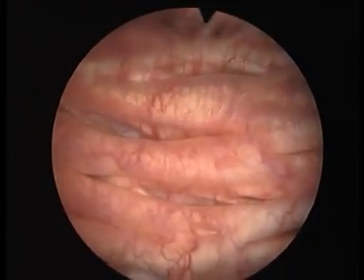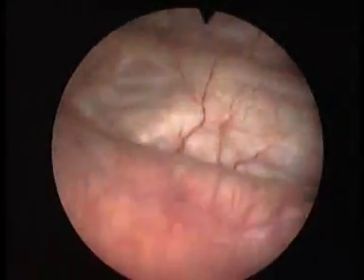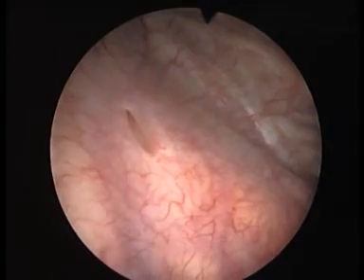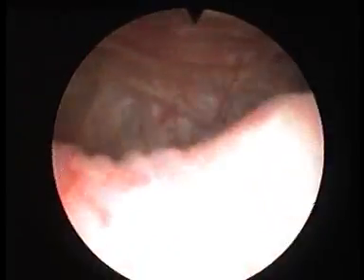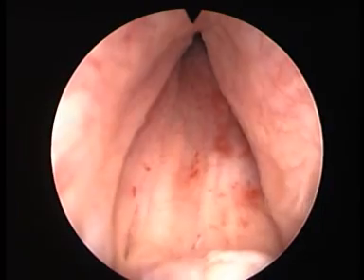Here we can see the inside of the bladder, and you can see the buildup of muscles which is caused in this case by an obstruction of the bladder neck. Looking at the right ureteric orifice where the urine comes down from the kidneys, and there's the left ureteric orifice. There's the bladder neck in the middle and the lobes of the prostate on the right and left.